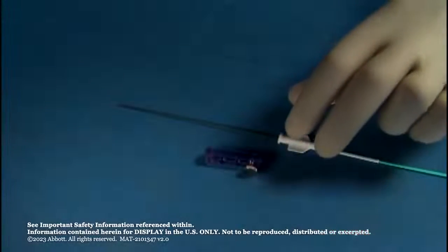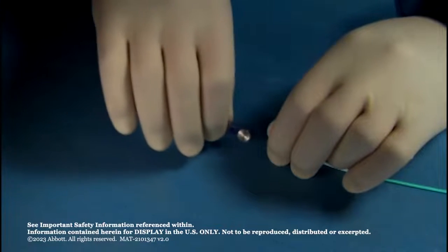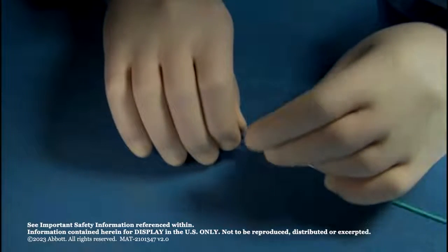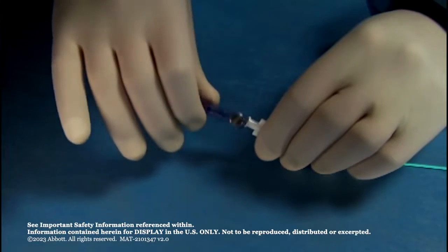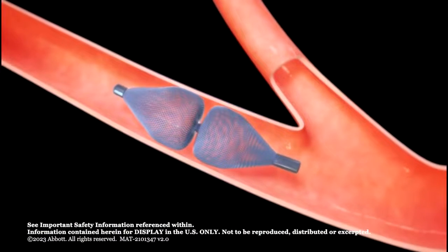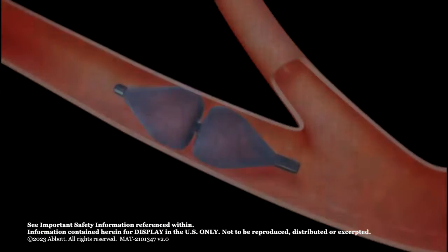When the Amplatzer Vascular Plug 4 position is satisfactory, attach the plastic vise to the delivery wire. Stabilize the diagnostic catheter and rotate the delivery wire counter-clockwise until it separates from the device. Retract the delivery wire into the diagnostic catheter and remove from the patient. Complete the procedure following standard technique.